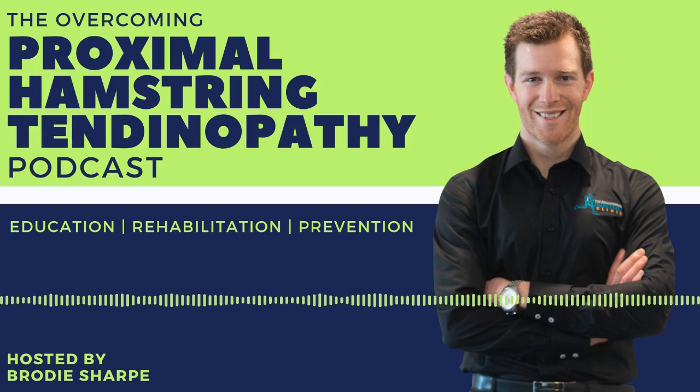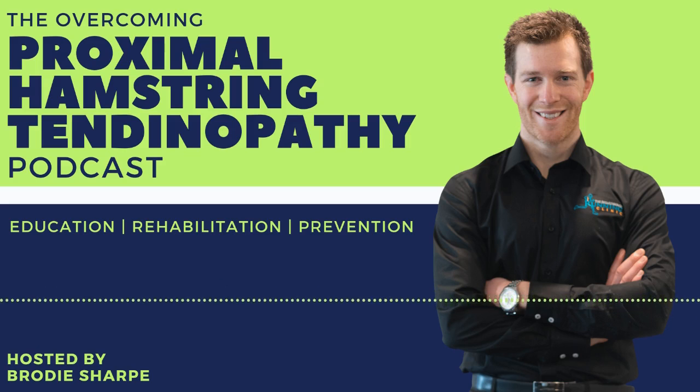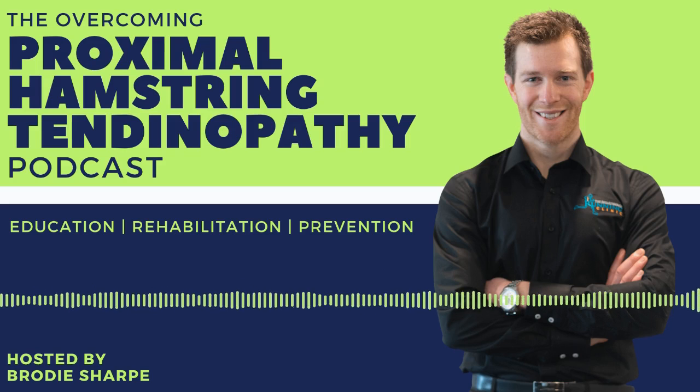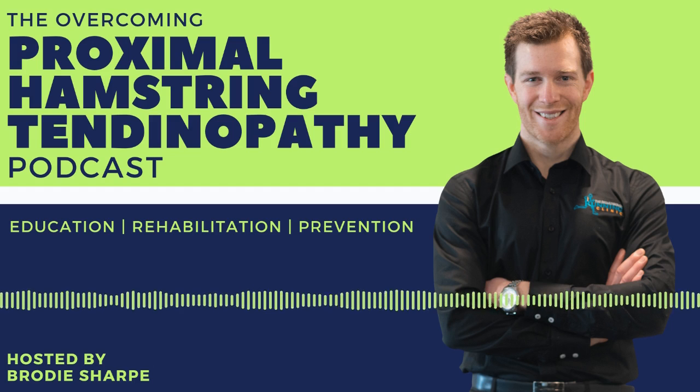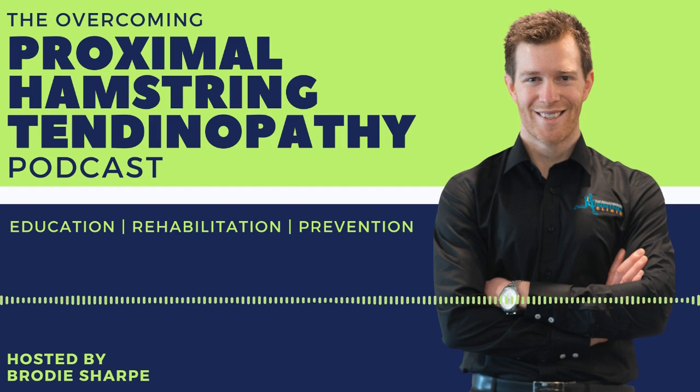So one of the biggest limitations, I would say, right from the beginning, what are the key limitations of Shockwave? Number one is it doesn't work in the acute stage, so it's not a good option. If somebody comes with very high levels of pain, you're not going to think of Shockwave. And the second major limitation is it doesn't work if the pain is diffuse. Maybe that's one of the reasons in tennis elbow, because the pain is not just localized. They say the whole arm hurts. So the more focused the pain is, the more likely you'll have success with Shockwave.